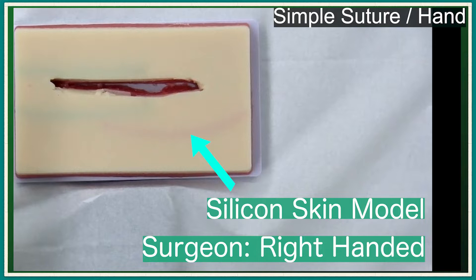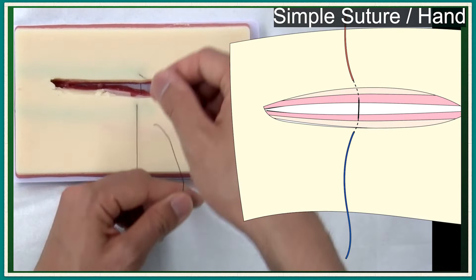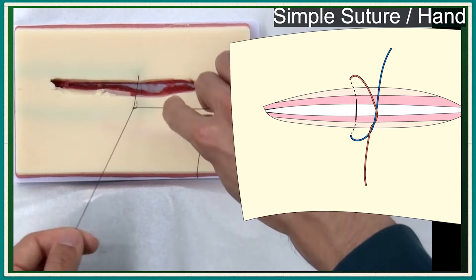In demonstration, the silicone artificial skin with a large gap is used. The surgeon is right-handed. First, I'm going to be talking about simple suture. Pass the suture into the skin. A simple knot is formed by two-handed knot tying.